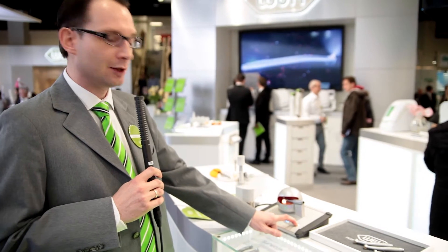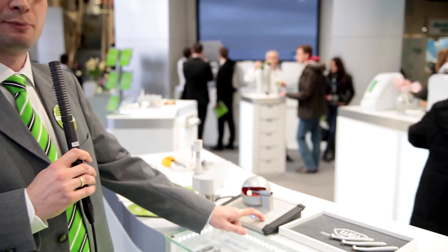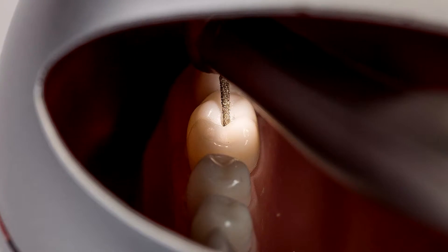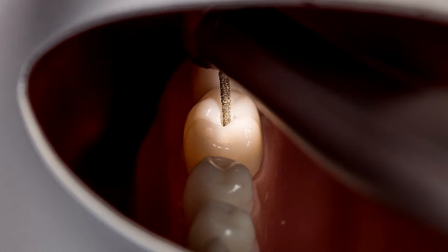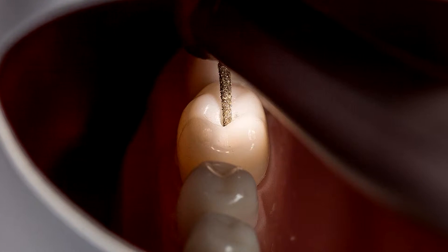To illustrate this more clearly, we have here a model to show the three different systems available on the market. On the one hand we have the halogen light, which is transmitted to the treatment site via fiber optics. You can see the yellowish light it produces and the shadows forming in the distal area of the molar.